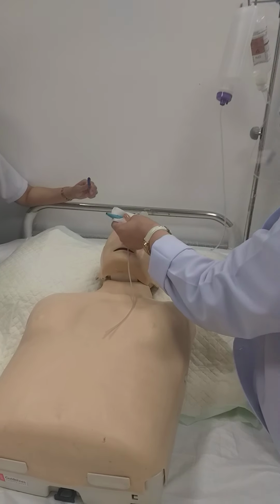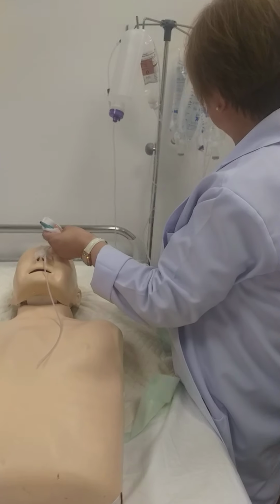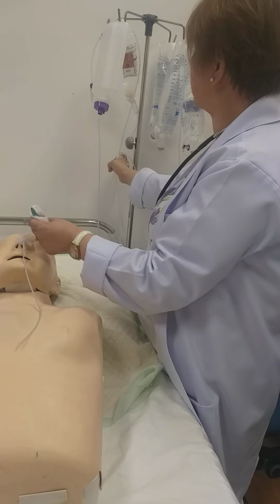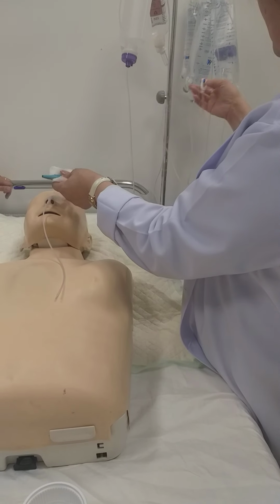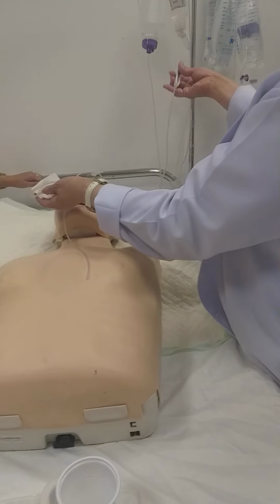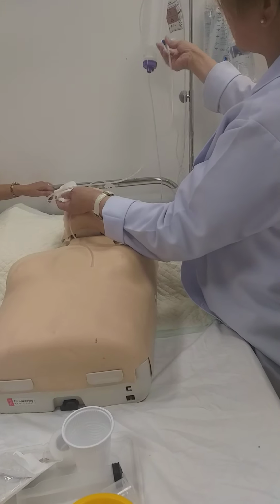There is nothing. So just assume this is the one. Okay, so you can put it on here, keep it high. Okay, so once it is attached, put it on and then wait until it is almost done. So once it is done, close this.